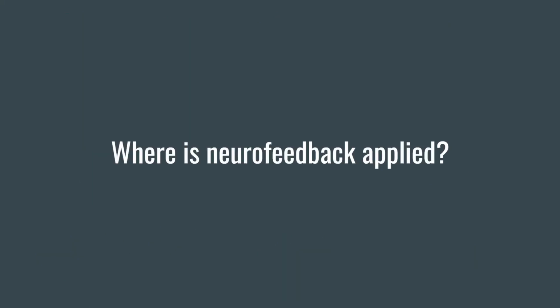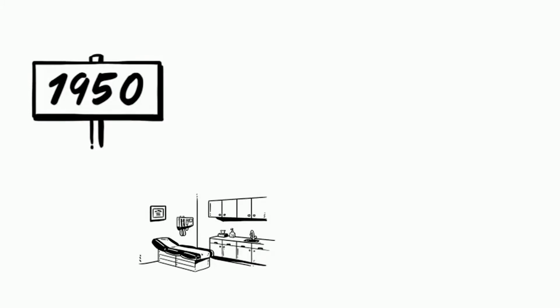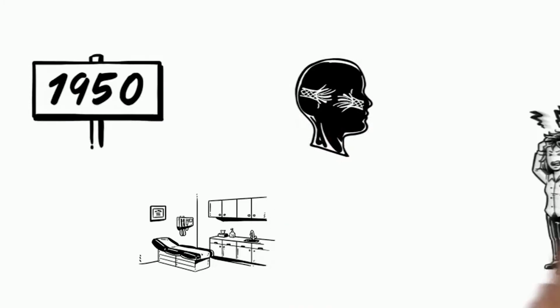Where is neurofeedback applied? Neurofeedback has been around since the 1950s and is used mainly in clinical practice to help people with conditions like ADHD, learning disorders, anxiety, depression, chronic pain, or migraine, for example.